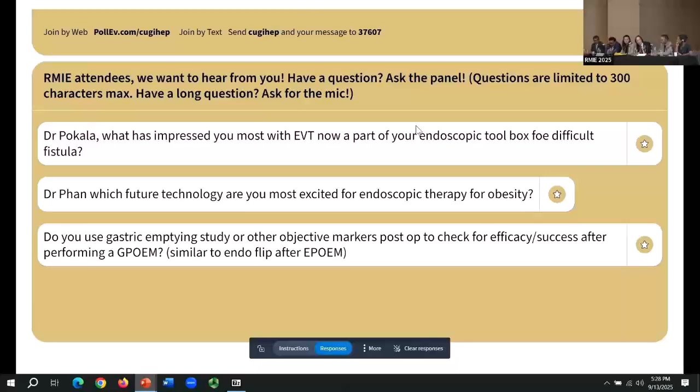My issue is really what Dick Kozarek pointed out in his original report, which is that these stents want to straighten out. They look great on the brochures, right? They make a nice C curve and all, but as soon as you deploy them, they want to straighten out. And that's really, I think, the problem when using these in the duodenum versus the esophagus, which is obviously a straight pathway. Ryan.